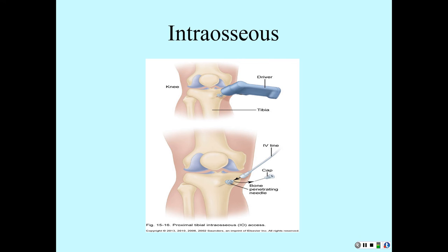And they've got a new one now that I saw in the spring. I can't remember what the name of it is, but they're putting it up into the humerus bone up here, and you connect it up, and they use those during resuscitations as well because it takes no time for it to go from here to the heart. Pretty neat.